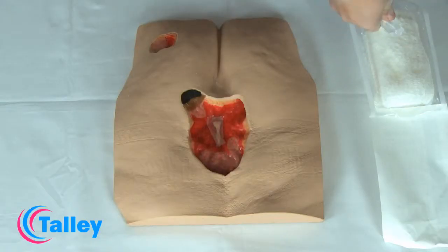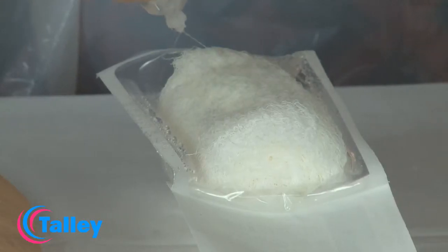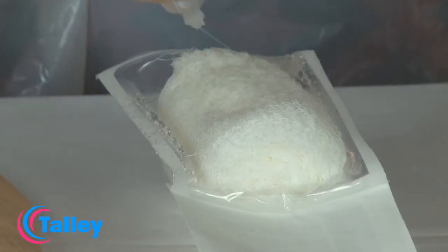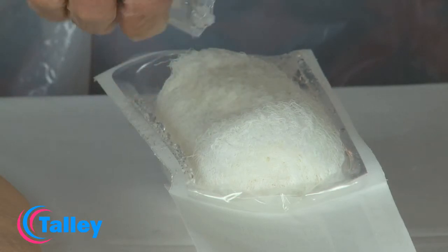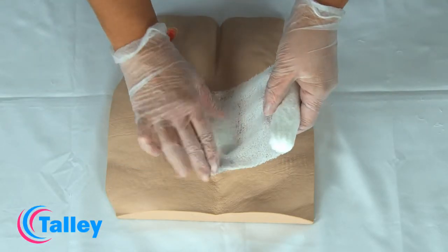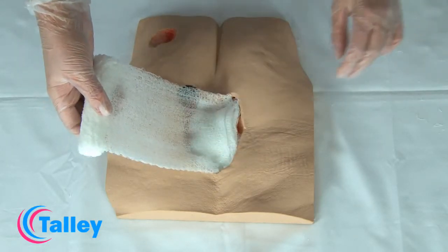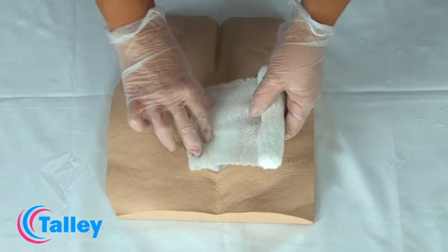Moisten the gauze with the saline. It is important to make sure the gauze is only moistened and not saturated. Place the moistened gauze into the wound to fill the cavity, ensuring that the gauze is in contact with any undermining or tunnelled areas.